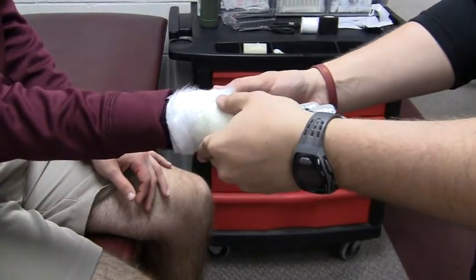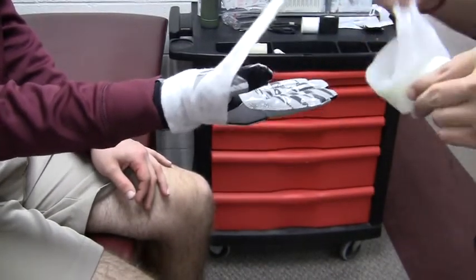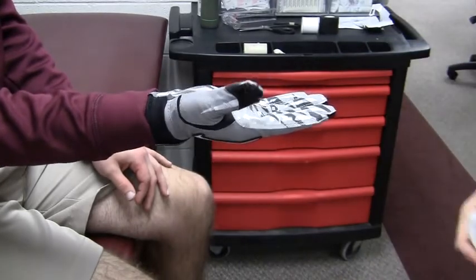Slide the cast off of the athlete's hand. Remove all cast padding from around the athlete's hand and from within the cast.